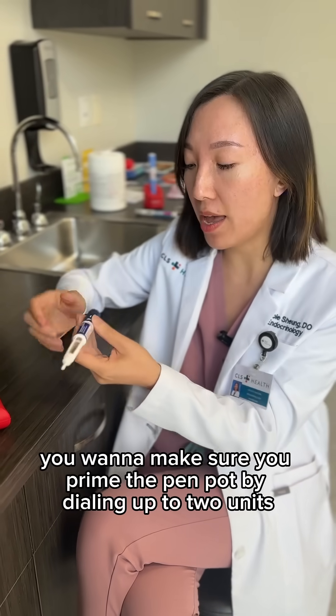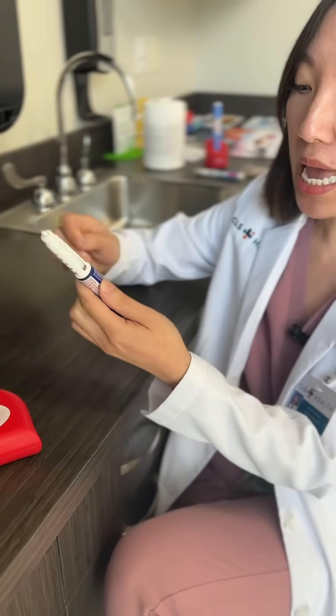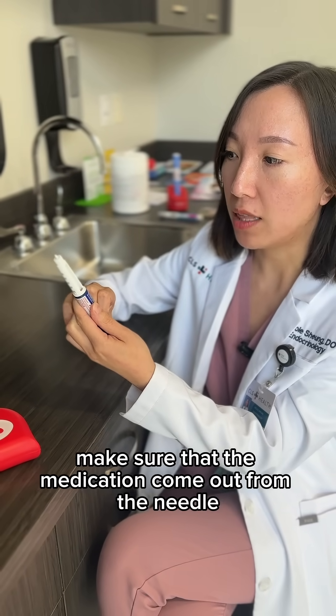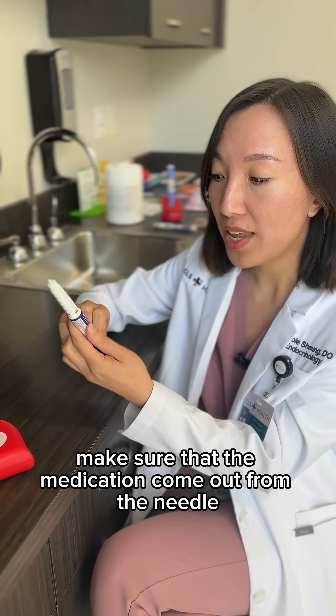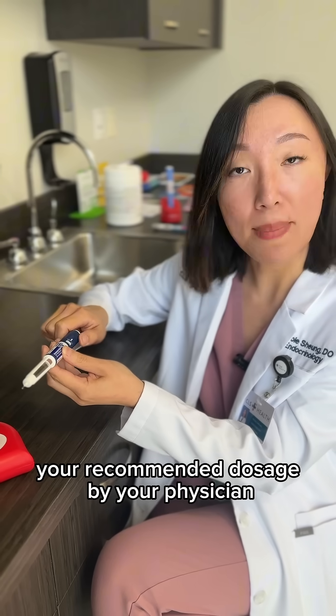The second step: for the first time you use each insulin pen, you want to make sure you prime the pen by dialing up to two units and then make sure that the medication comes out from the needle.